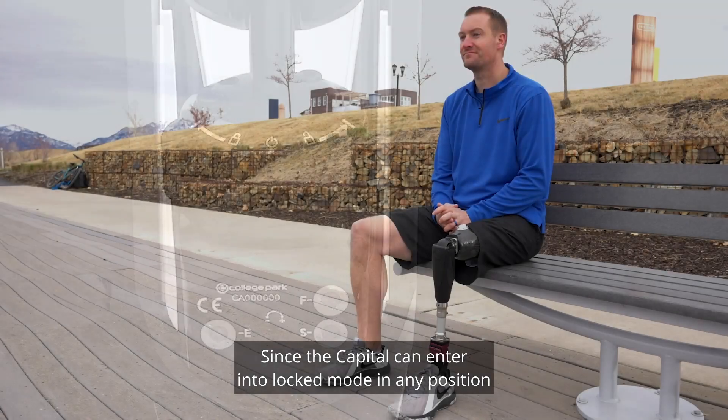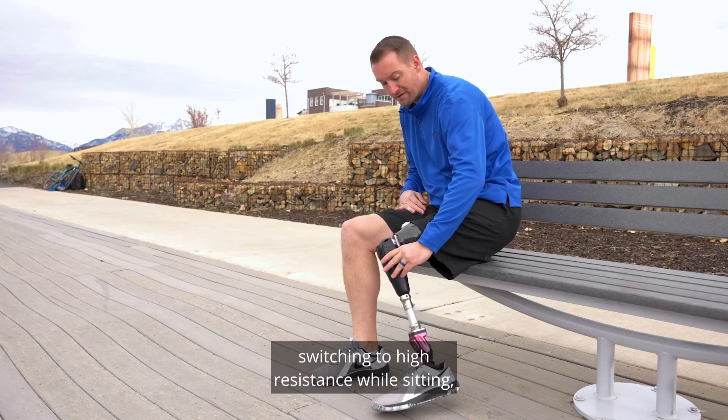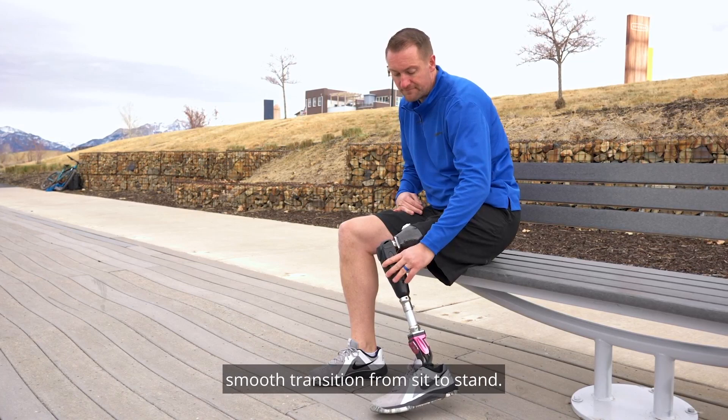Since the Capital can enter into locked mode in any position and extend freely, switching to high resistance while sitting can allow for a more stable, smooth transition from sit to stand.